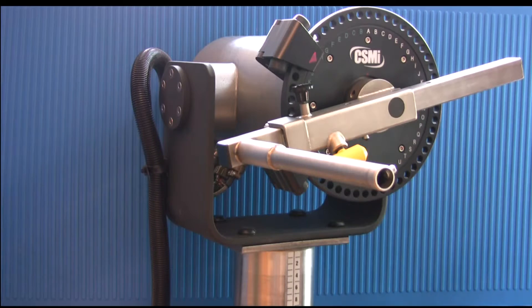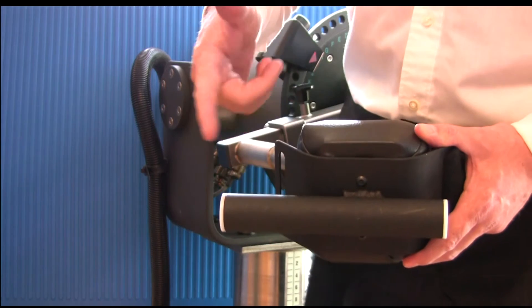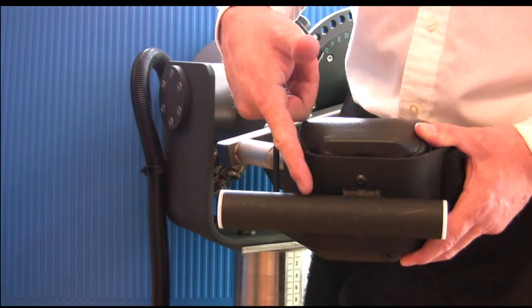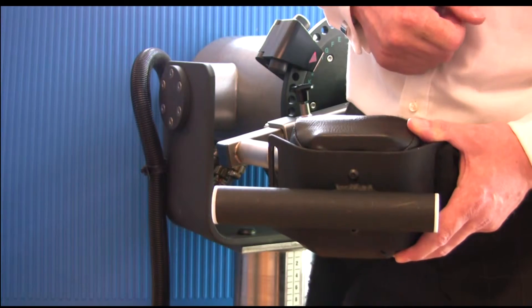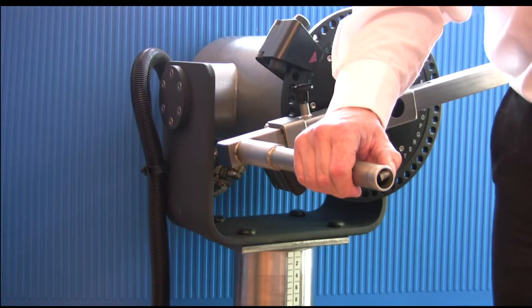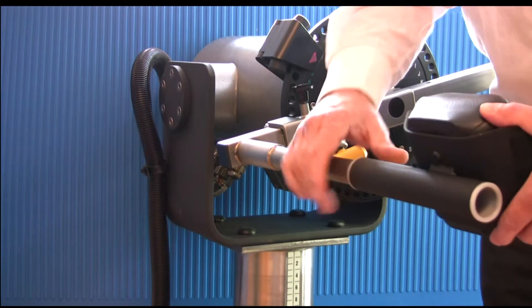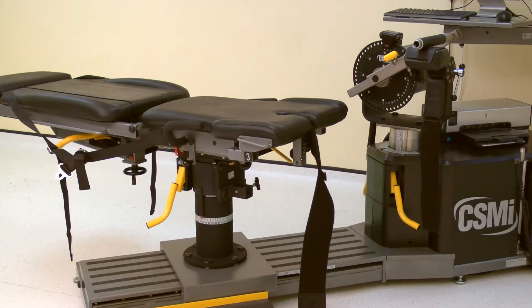To attach the knee hip pad to the knee hip adapter, first choose to use either the long or short end. The different lengths account for tibial offset. Press the retaining button on the knee hip adapter, then slide the pad into position. Once the arm is positioned, ask the subject to lay prone on the chair.